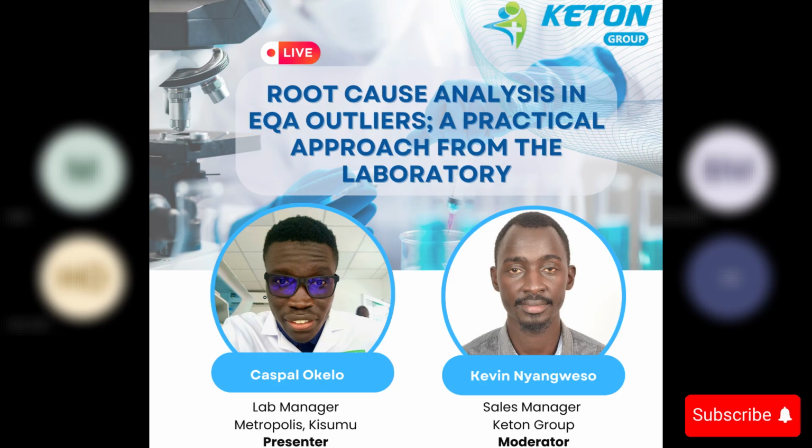And one thing that maybe I'll just mention in passing, which is a very strong thing that we do, is patient averages. You check for patient moving averages. Maybe has your average HB shifted compared to previous months? Previously, you were getting HB 15, 16, around there. Then suddenly, your average HB is at 17. So if the patient moving average has shifted in the same direction as the QC, it will strengthen the evidence that your analyzer is biased.